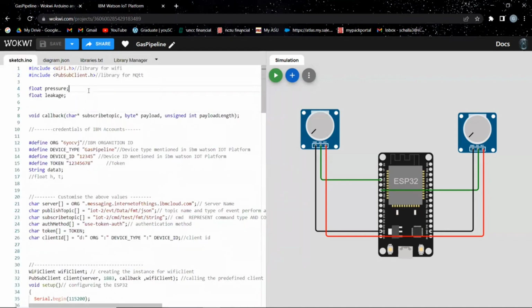So let us go back to the code now. Moving ahead, we will define the pressure and leakage values by giving variables to them. And then we will define a method called callback in the later code lines. Going down, we give out the credentials of the IBM account, the account in which we have created an IBM device. For that, we will provide the IBM organization ID, the device type, and the device ID. Device ID is nothing but the number, and type is the name of the device, and then the token, which is the authentication token, and data3 is nothing but the payload.